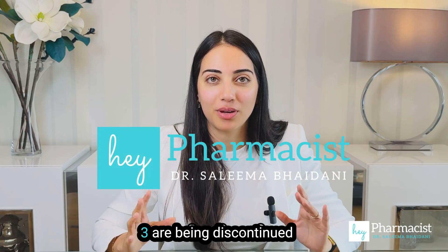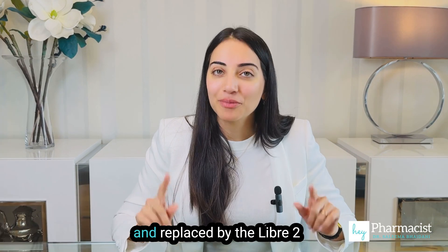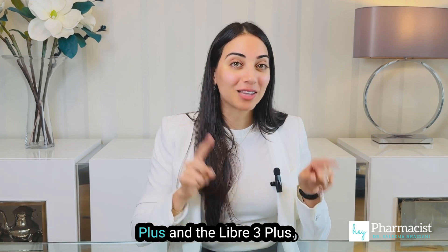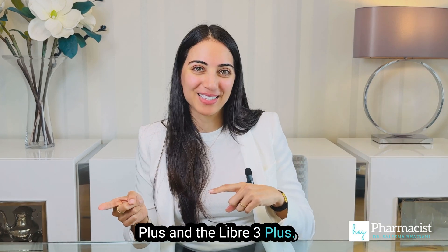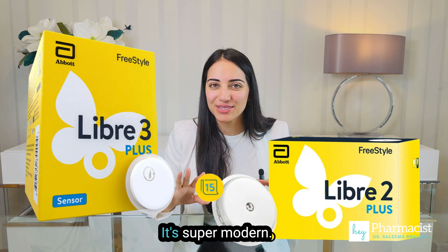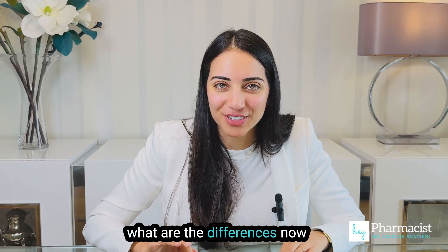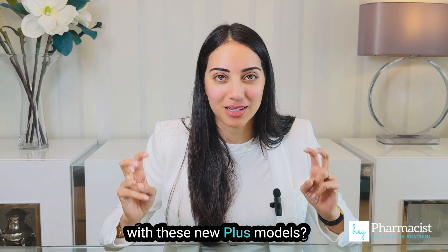The Libre 2 and the Libre 3 are being discontinued and replaced by the Libre 2 Plus and the Libre 3 Plus. Look at this new fancy packaging — I really like the branding, it's super modern. I'm all for it. What are the differences now with these new Plus models?